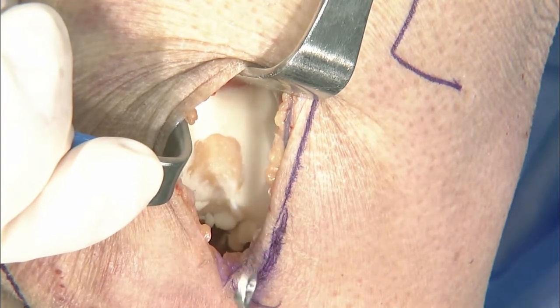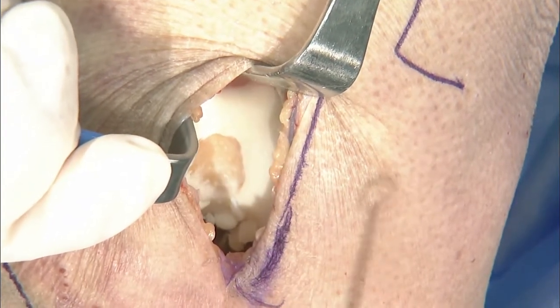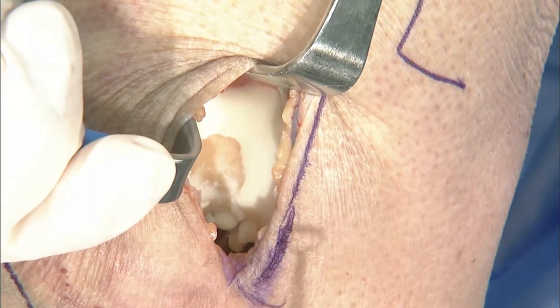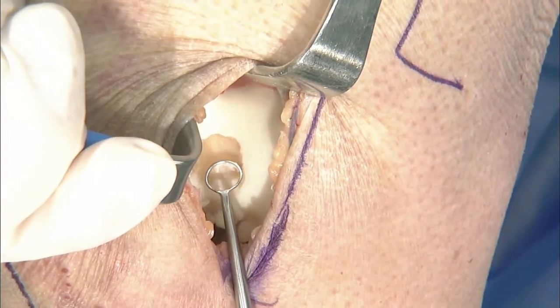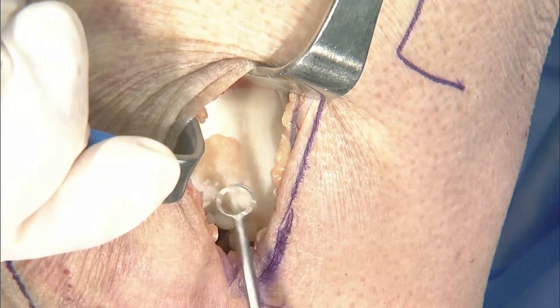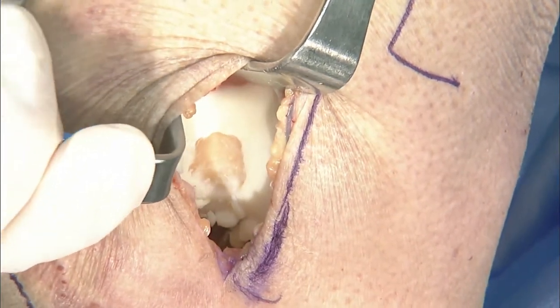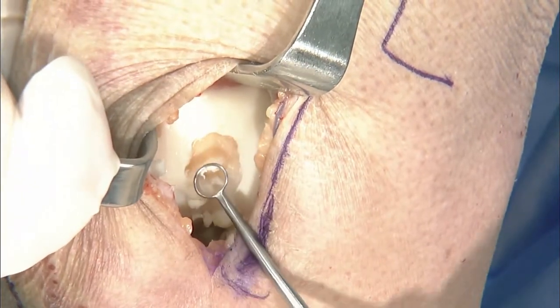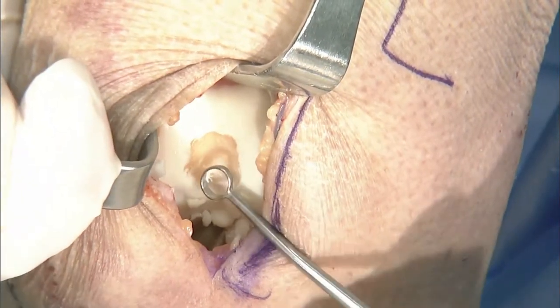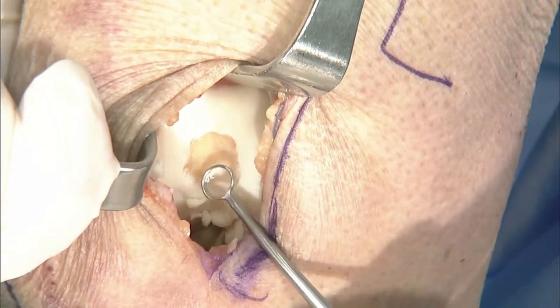If that doesn't work, I'm not totally opposed. I don't like to do it, but I will use a burr just real lightly across that intralesional osteophyte if I really can't get it down to what I think is healing bone. That's kind of my last resort because I just don't like the speed and the heat sometimes generated with the burr in those defects. But I don't know, Adam, what do you do in terms of when is enough preparation for you and what you do with an intralesional osteophyte?